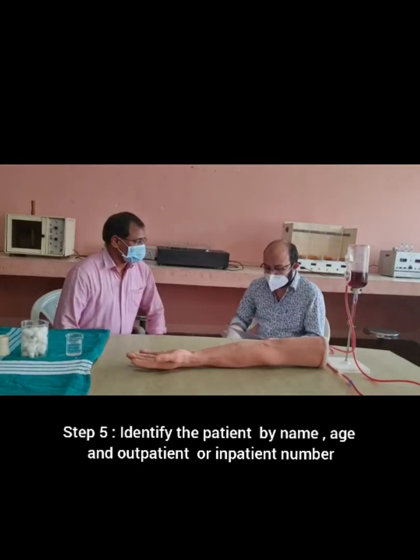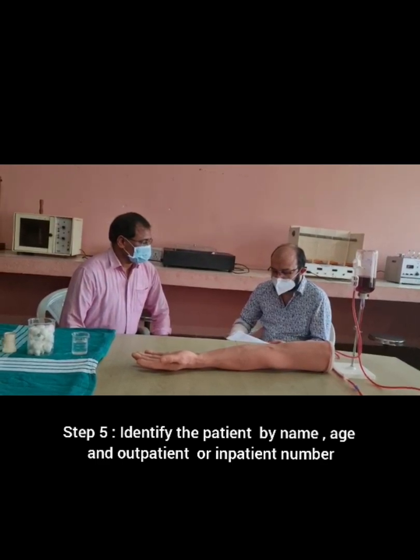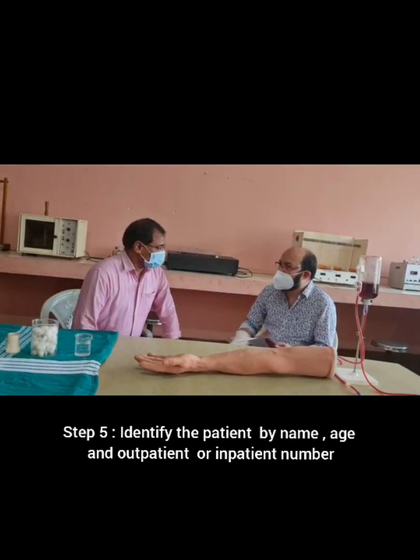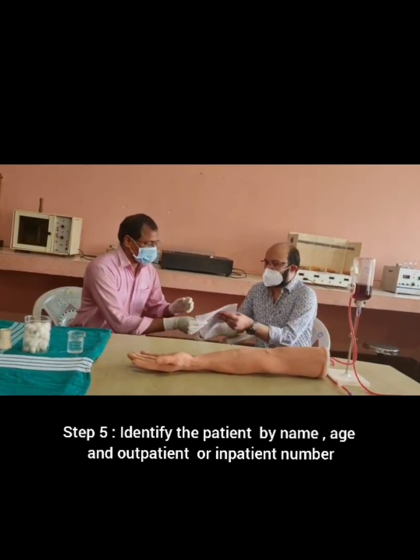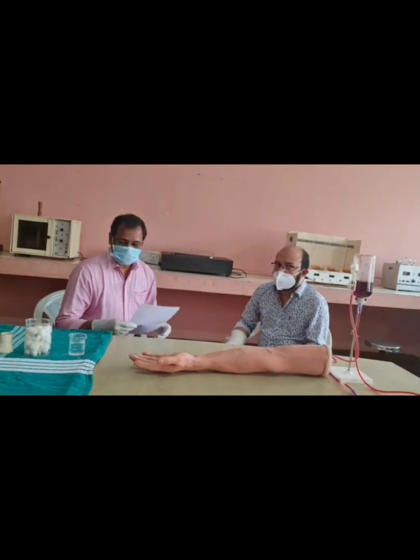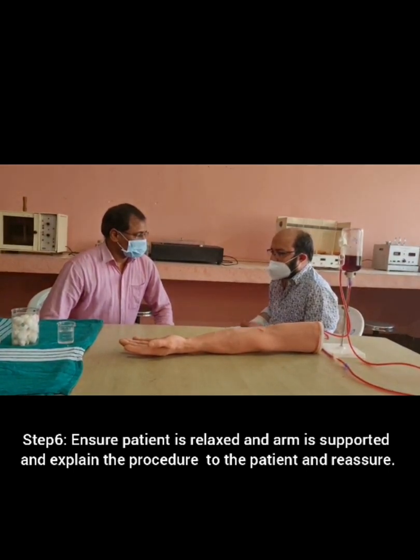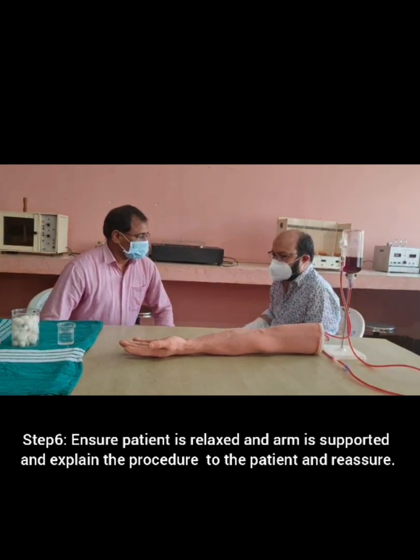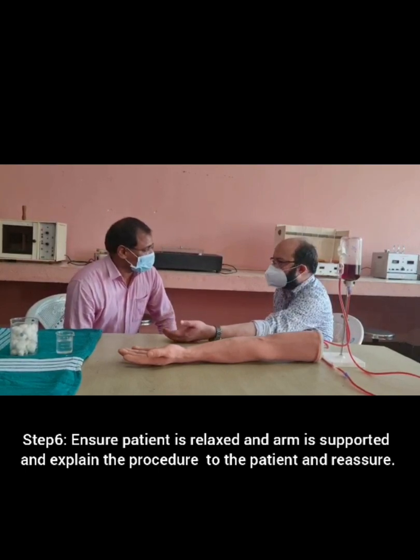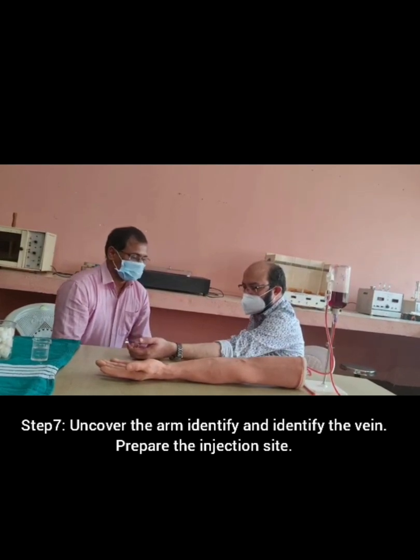Identify the patient by name, age, and outpatient or inpatient number. Ensure the patient is relaxed and the arm is supported. Explain the procedure to the patient and reassure. Uncover the arm, identify the vein, and prepare the injection site.